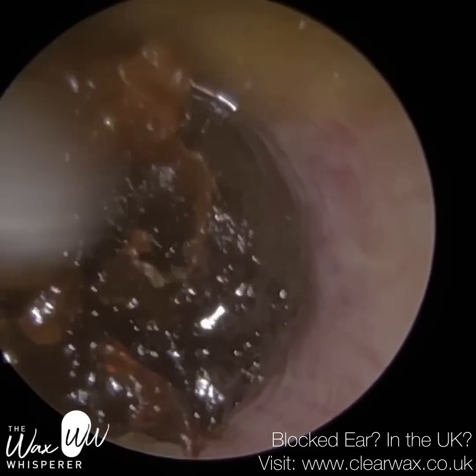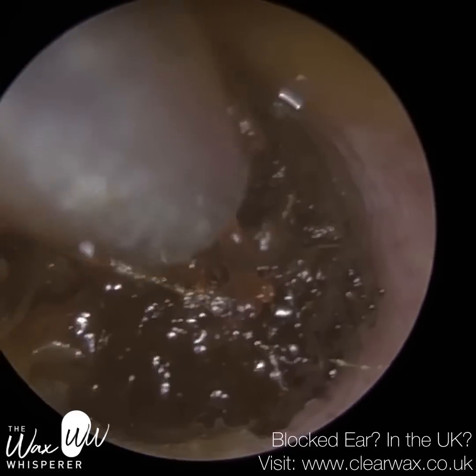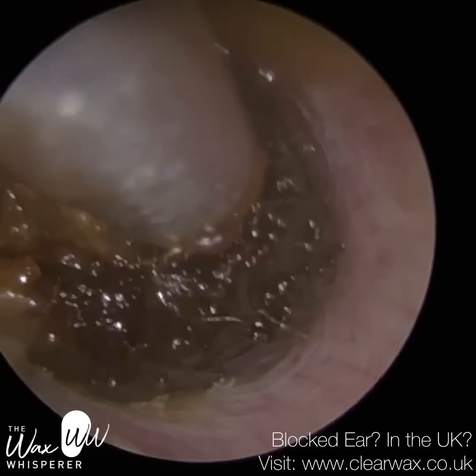This last piece is quite large. It's been there for a bit longer. You can tell by the colour it's a bit oxidised. I'm just going to give it a little wriggle. There's going to be some residual soft wax around the edge because of the amount of drops the patient used, but that's fine. A bit of wax is good for us, guys.